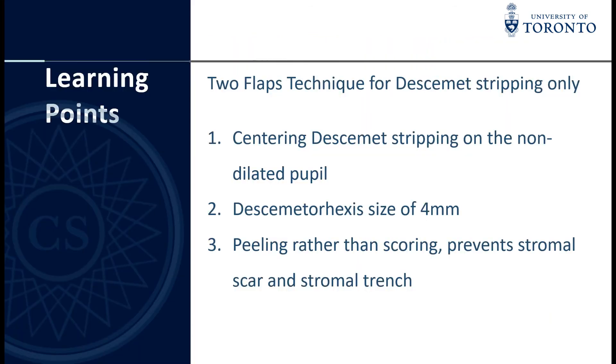Learning points for this two-flap technique for descemetorhexis-only: First, centring the descemetorhexis on the non-dilated pupil is important to achieve centration on the visual axis. Second, the descemetorhexis size must be within 4mm to help endothelial cell migration. Third, peeling rather than scoring prevents stromal scar and stromal trench.